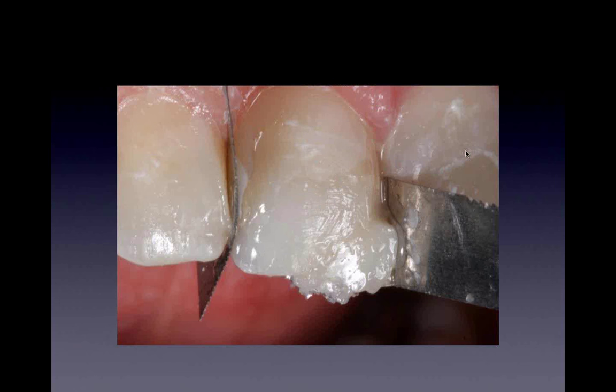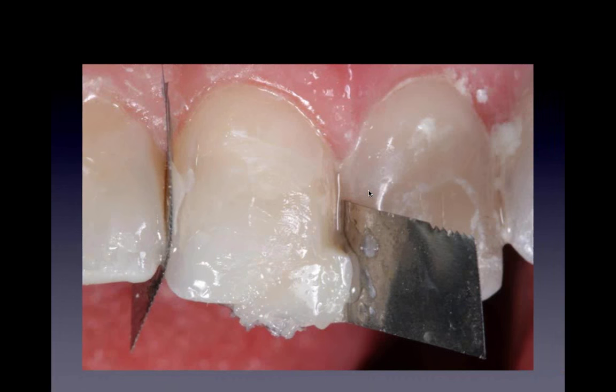Remember, these A2 different shades are very difficult shades because you have different calcifications here. So sometimes you have to mix it up. Here I'll put a little bit of A2 and a little bit of A1 just to mix it up, to get that little blending of composite, because that's really the trick on one of these. If the blending of the enamel is different, then you have to blend the composite. You can't just use one monochromatic composite. So here I'm adding a little bit of pearl frost at the end just to get a little trans on it, and building this back up.